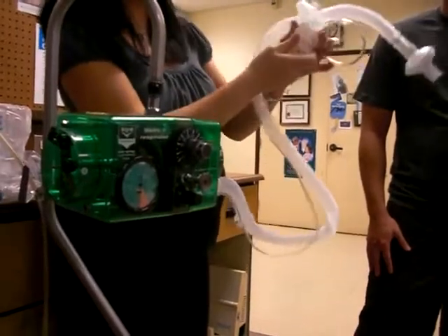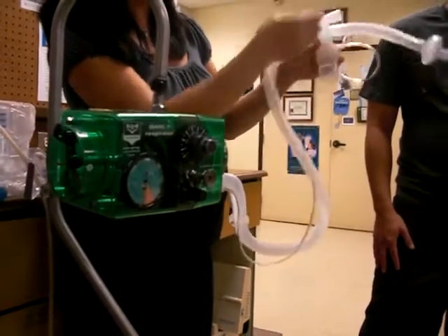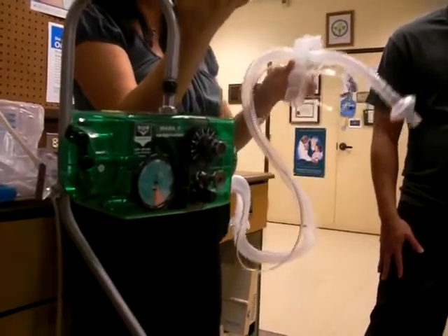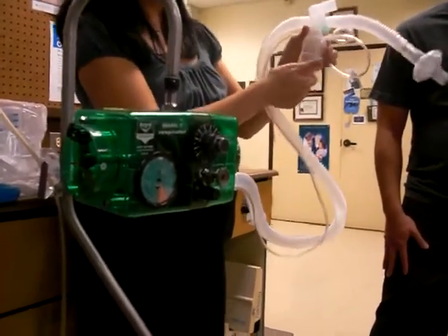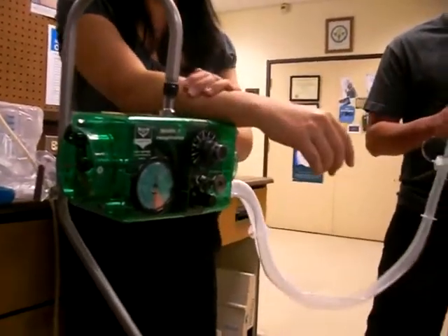Or you didn't thread this in properly. That's always an issue, it's not threaded in properly, and so when the patient takes a breath, it leaks. If the patient's holding this and their hands are all of a sudden wet, it means that you needed to thread it in and it was leaking out and the drug just got wasted. Okay, so make sure that this is set properly. And that's it for those 2 slides for troubleshooting.